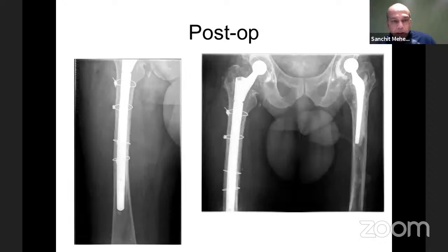So post-operatively, this is what we did. We opted for a long uncemented stem. When you change your modality of fixation from cemented to uncemented, you have to be fairly meticulous about taking all the cement out, and then that will afford you a good level of fixation. Then restore the tube with cables.